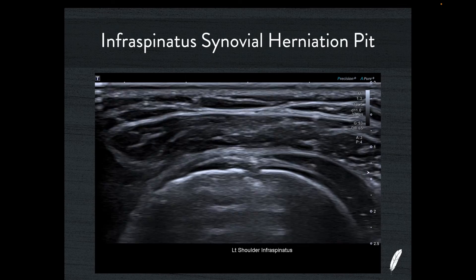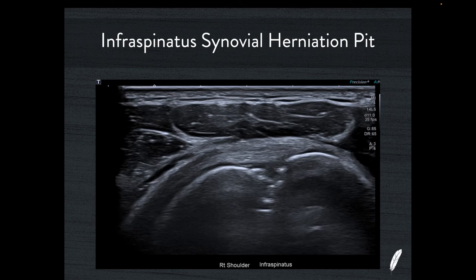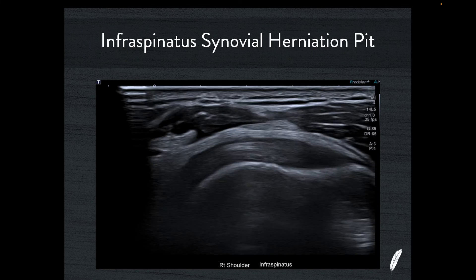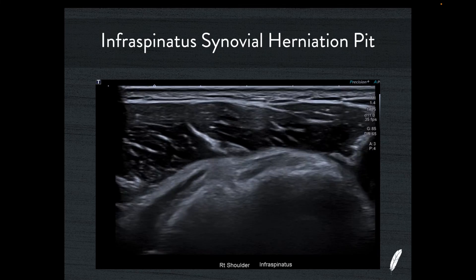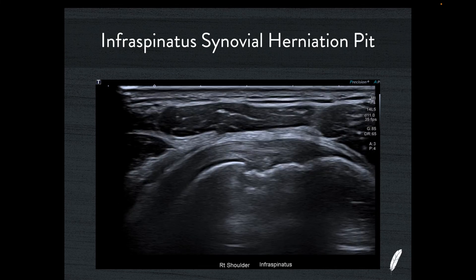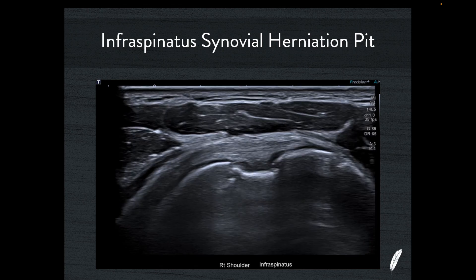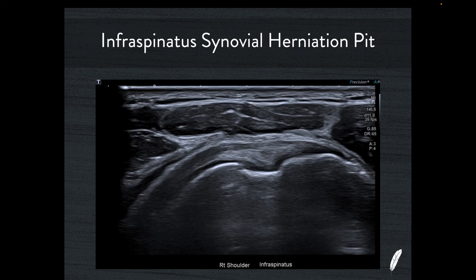We might need plain radiographs for a start and maybe even some cross-sectional imaging to answer the riddle. Here's another example of quite a broad synovial herniation pit in the infraspinatus — you can see how if this patient had had a dislocation, you'd scratch your head and think: are we looking at a Hill-Sachs deformity or a synovial herniation pit? It can be really difficult. That's why we rely on plain radiographs and cross-sectional imaging in these cases. But as you gain experience in musculoskeletal ultrasound, you'll see this type of appearance week in, week out in patients with no history of trauma, and even in young healthy volunteers at workshops.